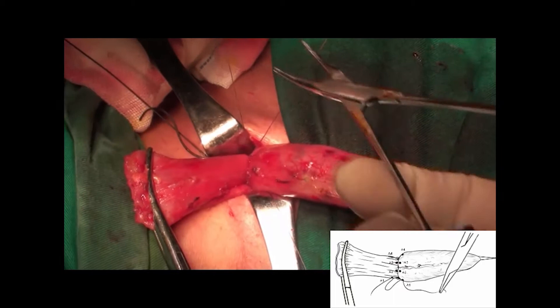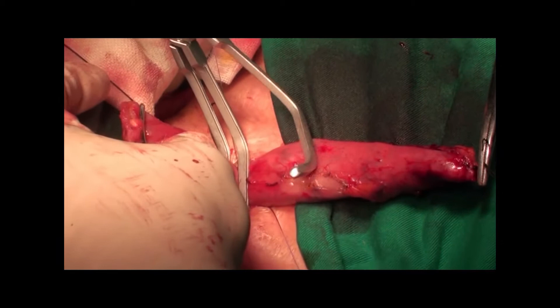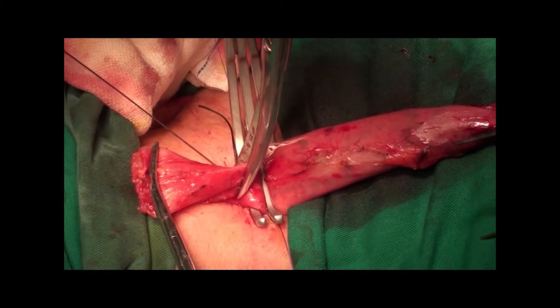Mosquito forceps were used to hang the suture to define the corners of the layers. The gut retractors were removed. A three-leaf clamp was used to fix the esophageal stump and gastric conduit to facilitate the suture procedure.